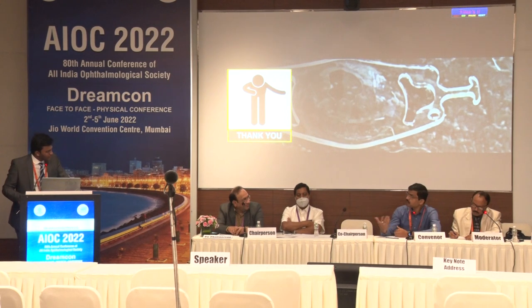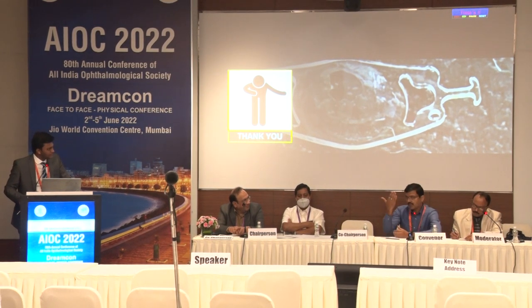Yes. So the reason why I'm asking this is the flutter of the iris in post-vitrectomized eyes actually causes a lot of issues with the posterior fixation of the iris claw IOL. So I always send out a red flag to my fellow surgeons not to use an iris claw IOL if the patient is secondarily being done after vitrectomy, because the iris flutter also tends to flutter the IOL. Absolutely. And sometimes the patients complain of a very strange oscillopsia. They say the vision is clear, but it's kind of shaky.